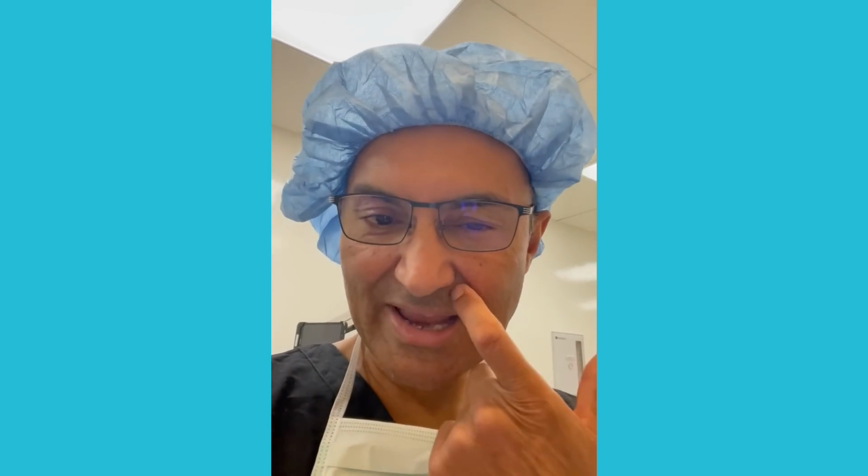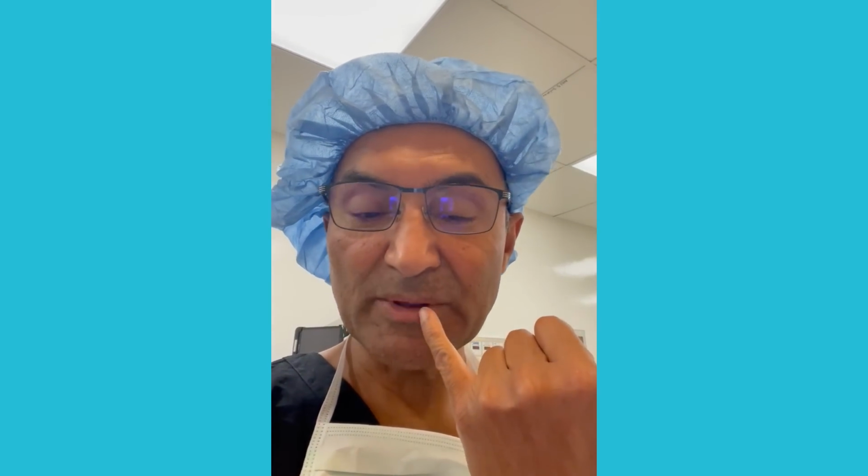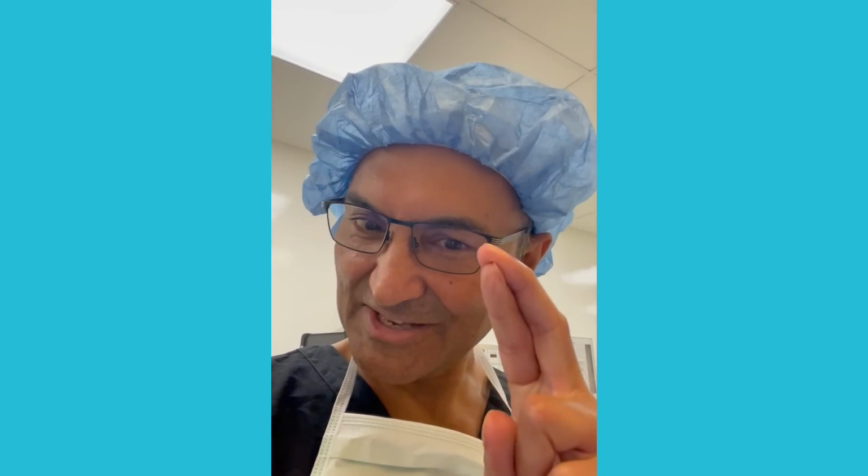The dilemma was there's no punctum. I can't see a punctum, and I cannot be sure. So I don't want to make a scar if I can avoid it, but I want to be able to remove it completely as well. So it's tricky. So I am going from the mucosal aspect on the inside and then just trying to dissect it out. It's a little different approach, but I think it should work out because by palpation, it is pretty well defined. So let's get going.